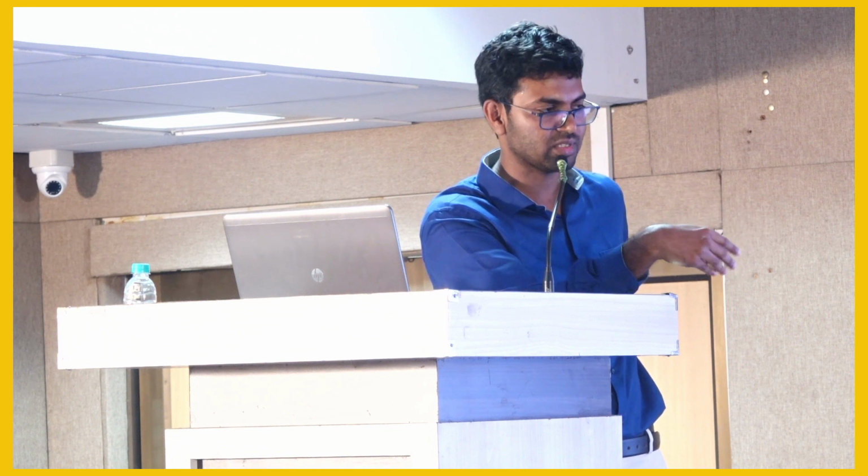But whenever you initiate ECMO in a patient with a CO2 of 80, don't try to bring the CO2 down to the 40 level immediately. That will cause acute cerebral vasospasm. So don't start with a high sweep gas flow. If you are starting with a pump flow of 4 liters, start a sweep gas flow of 2.5, and check the arterial blood gases and see how the CO2 is. If you suddenly make the CO2 normal, what is normal to us, there will be a sudden respiratory alkalosis and cerebral vasospasm. So you slowly increase the sweep gas flow.